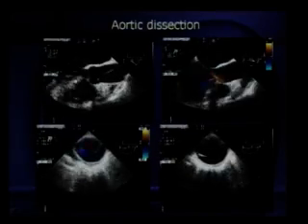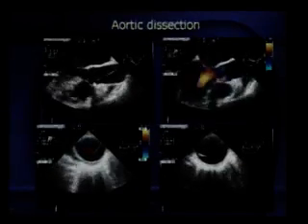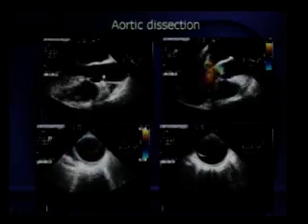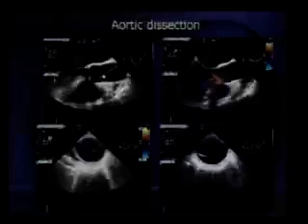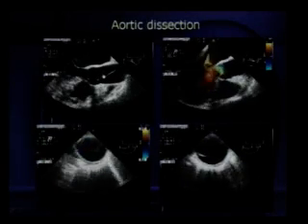Here this is a good example of the fact that this TE shows you very clearly the point of entry and the flap very clearly. So aortic dissection is another condition causing aortic regurgitation. Okay, and this is just to give you a trailer of what's in store.